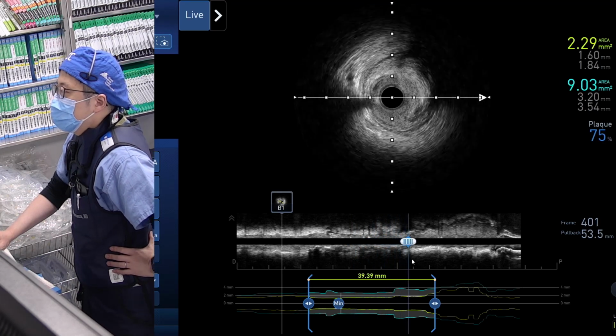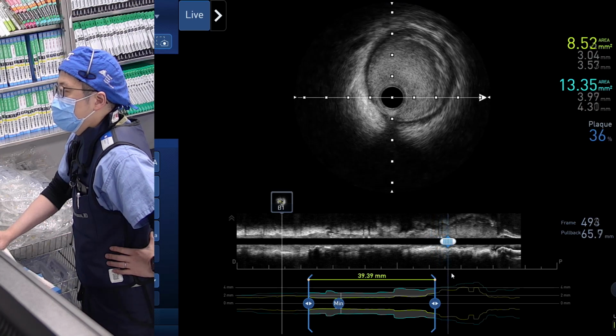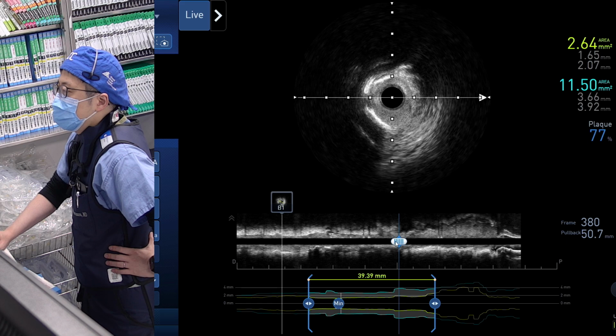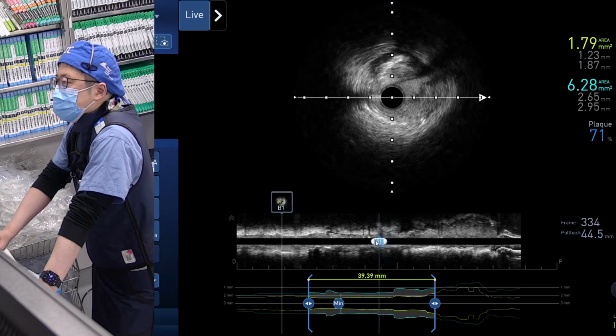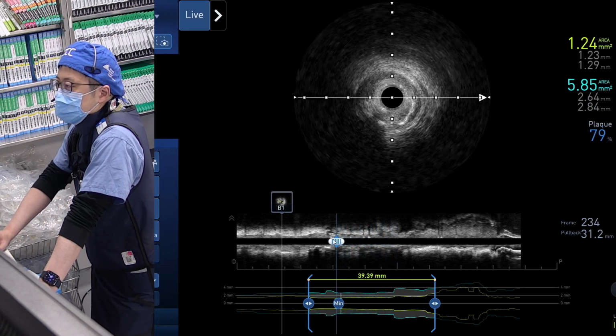2.5 by 48 stent. There was an area with significant calcification. Yeah, one arc, but less than 90. No, there are two, more than 90. Yeah, more than 90, that's what I thought. I can tell you on the previous angiogram it looked like more calcium, but today I could not say. Maybe the IVUS view is so clear.